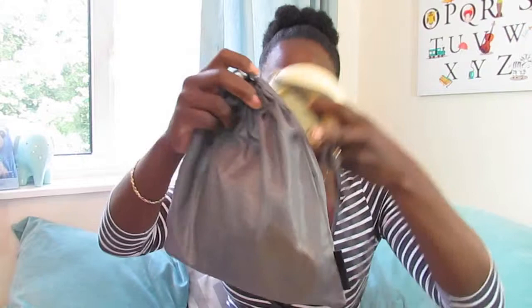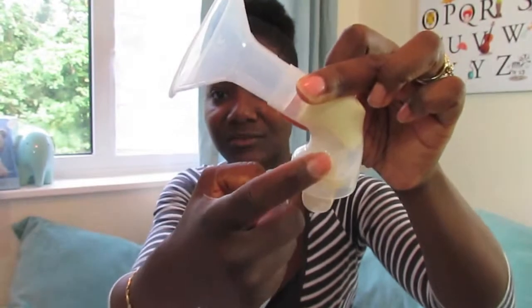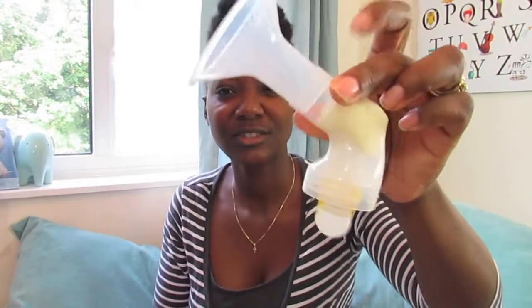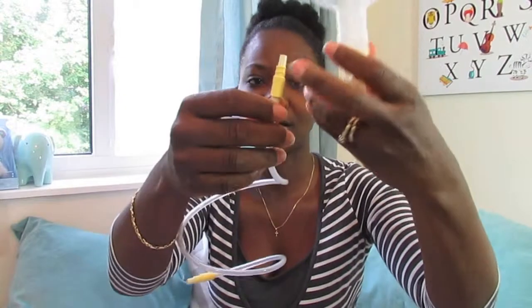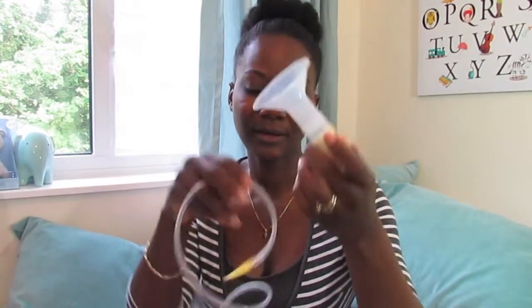It comes with a bag so you can put all the accessories in and carry it around — really handy. I'll show you what the attachments look like. It's basically a three-part assembly: this part detaches from this, which detaches from that. It has a hose that connects everything and then you just pump away. This part fits nicely and comfortably.